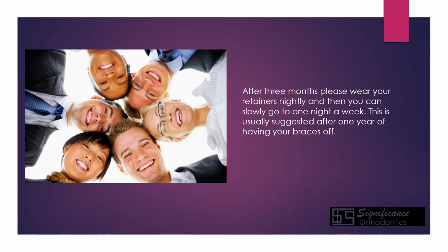So now after the first 3 months, you can actually go just to nighttime wear. So, after you get home from work, you want to go ahead and slide them in, that's fine. Again, take them out to eat, take them out to brush. But then after that, so let's say, it's a year after you have your braces off, you can slowly start backing away, never going away completely. Now, eventually though, you will be to maybe one night a week.